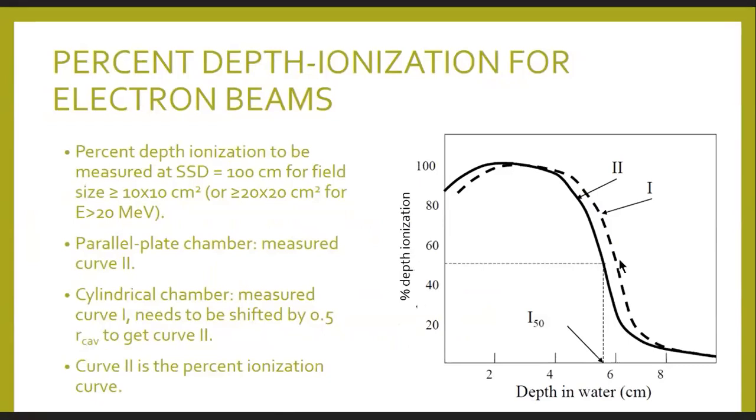Okay. So in case we measure the percent depth ionization using the cylindrical chamber, and Mamoon, yes, you have 5 more minutes. We have a good number of questions, so we'd like to leave some time for the Q&A, please. Okay. So quickly here, we can measure the percent.